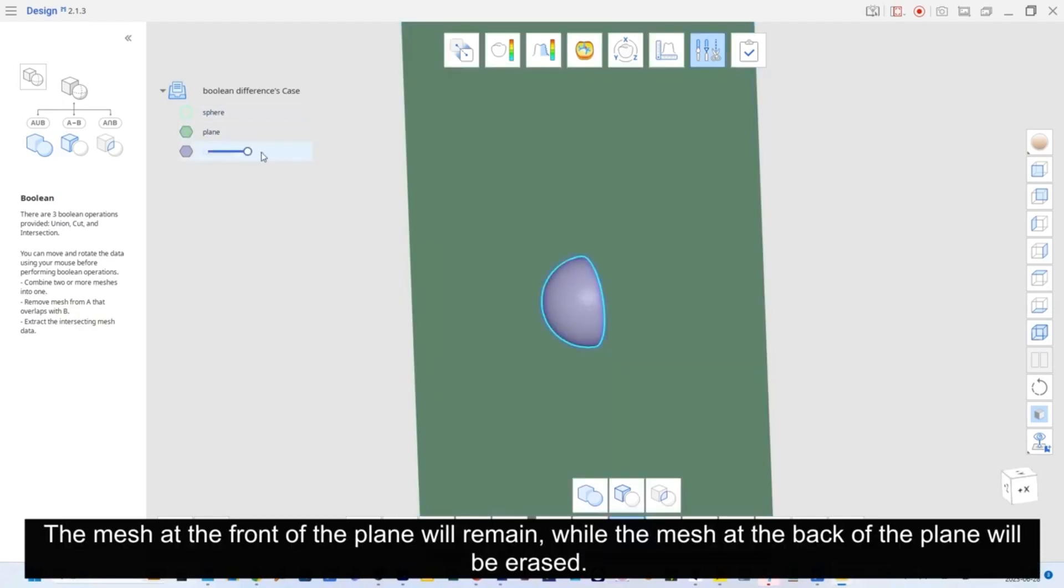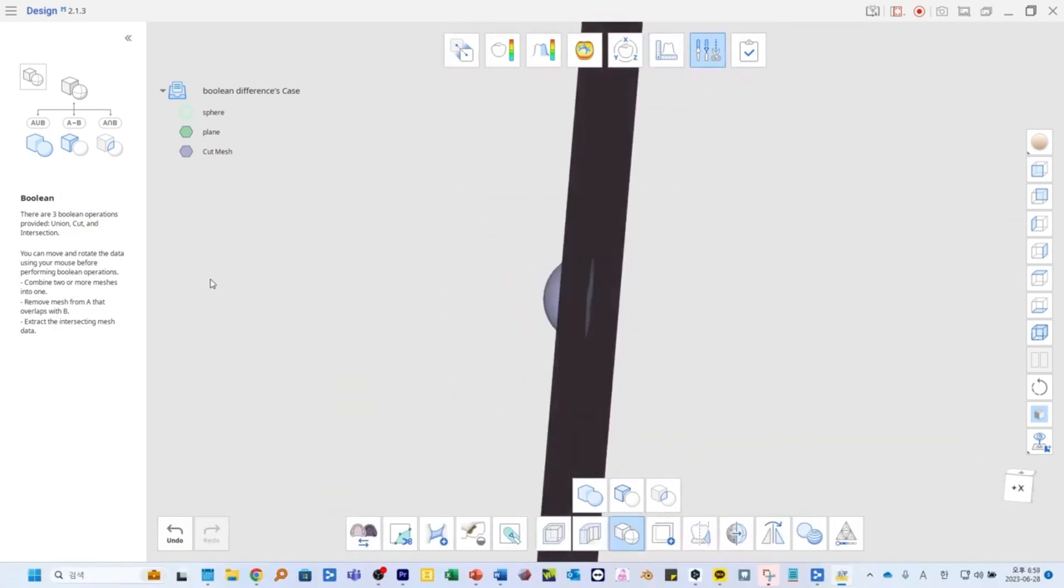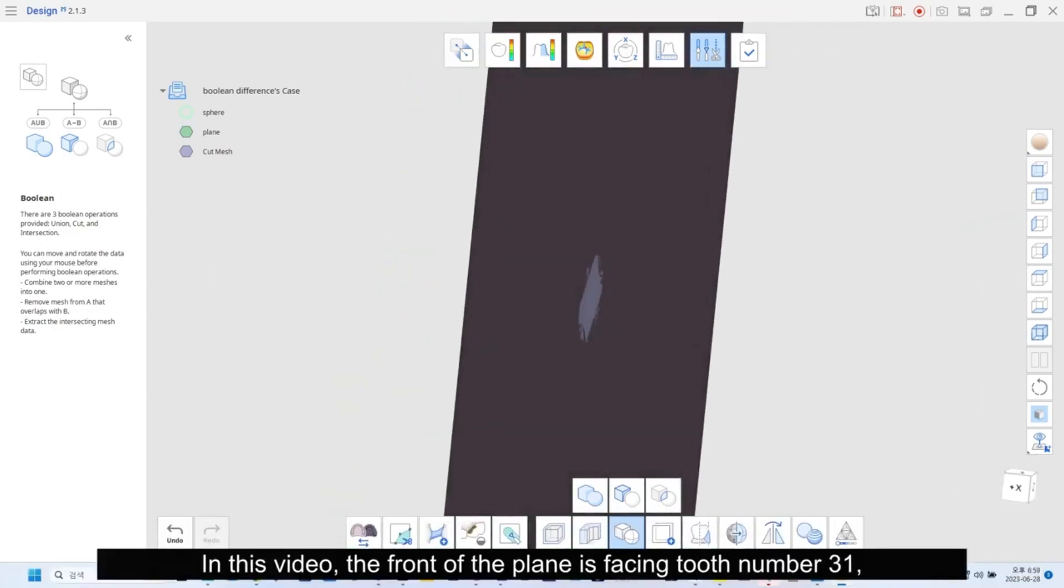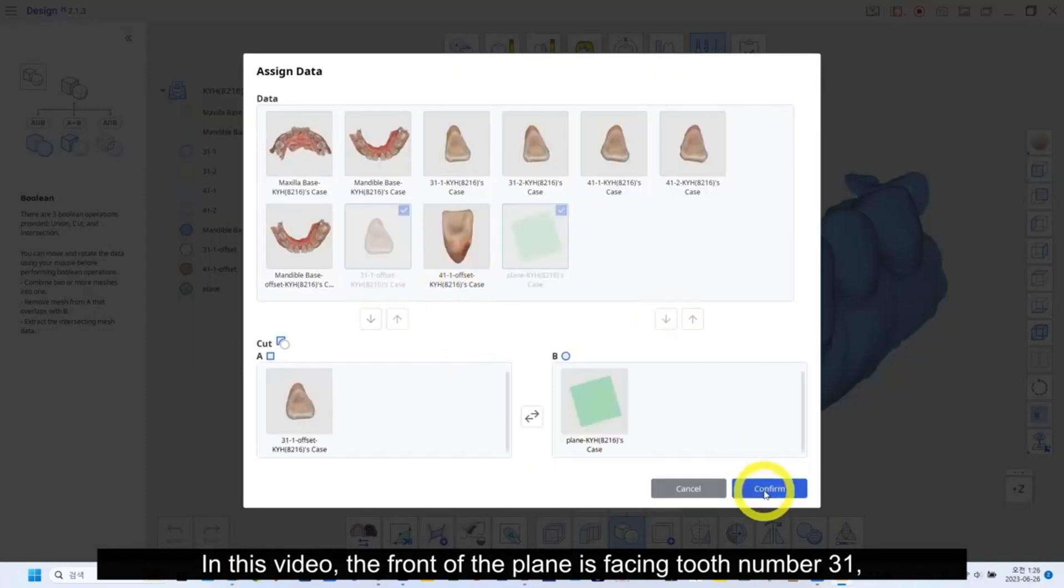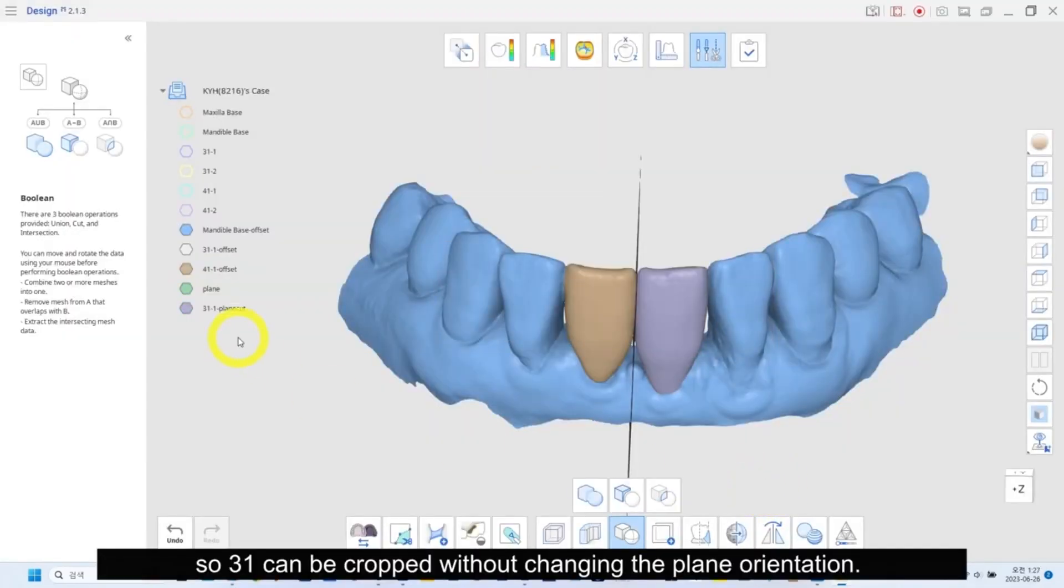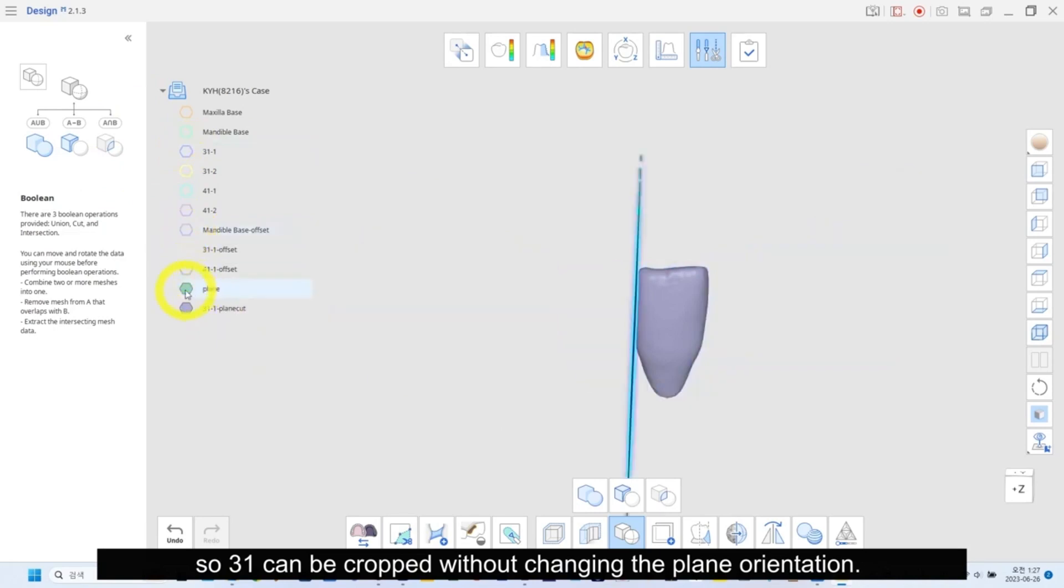The mesh at the front of the plane will remain, while the mesh at the back of the plane will be erased. In this video, the front of the plane is facing tooth number 31. So, 31 can be cropped without changing the plane orientation.